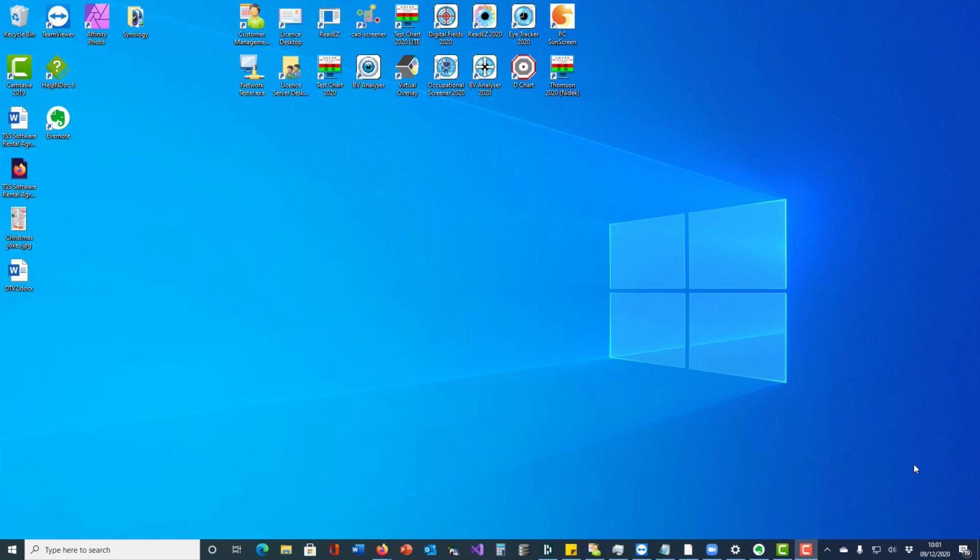In this video I'm going to be demonstrating how to set up the BV Analyser. So if you've installed the software yourself, you would have been sent a link, and when you download the file from the link and run it, it will run like a standard install file, and at the end of that process you should find an icon on your desktop called BV Analyser.